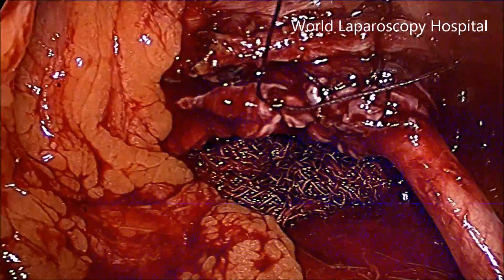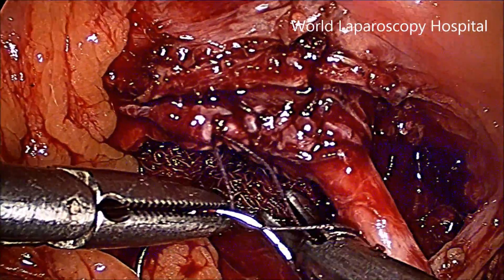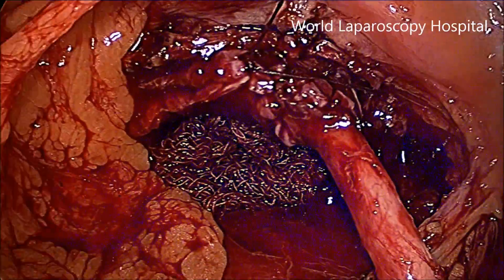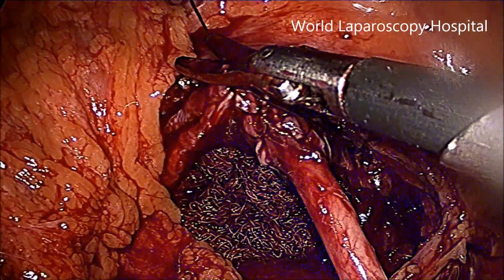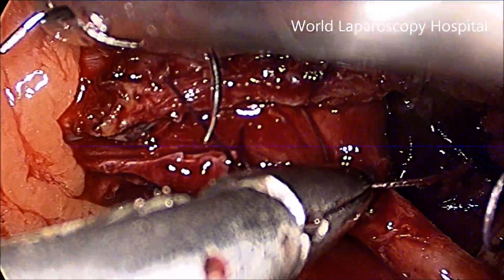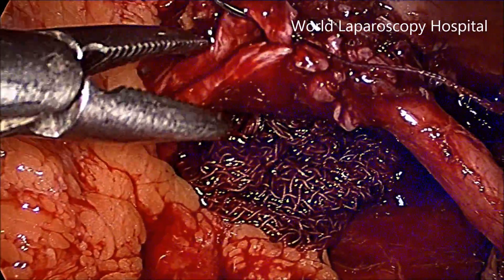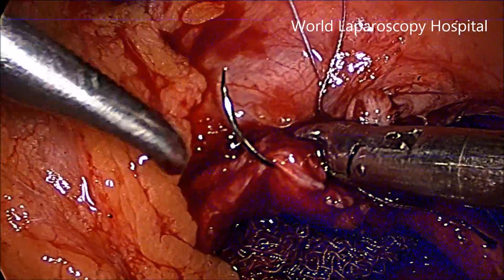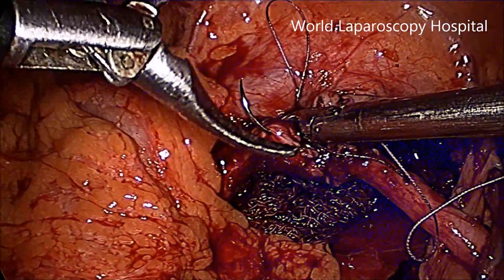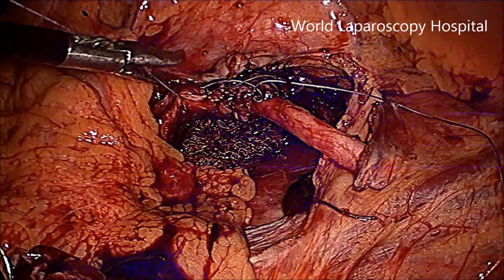There is a small gauze piece down there that is just to absorb all the blood, and sometimes it will be helpful to swab and rub it. A few more continuous stitches have been given to close the opening of the pelvis.